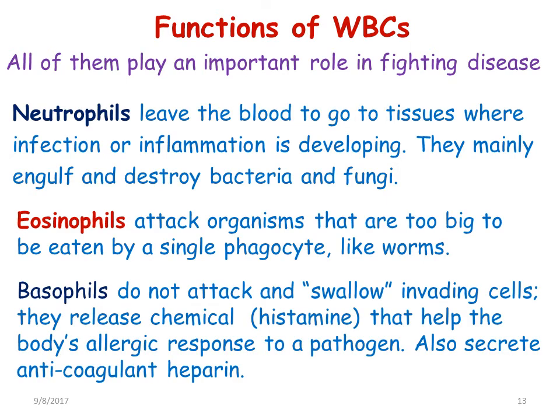Basophils do not attack and swallow invading cells. They release a chemical called histamine that helps in the body's allergic reaction to a pathogen. Also, they secrete anticoagulant heparin.